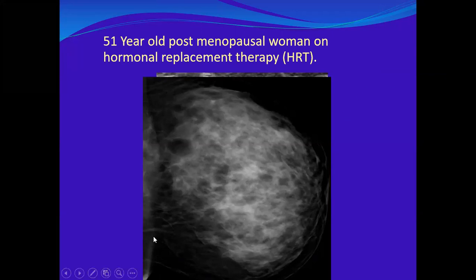This is MLO. I don't know, it is CC. It is a CC. Yes, agree. So in the outer here, yes. Where is the mass? Is this a mass? No. Small, very small. Here? Yes. This one? Yes. Okay, other suggestion? No, this is not the one. Look carefully. You can see it?